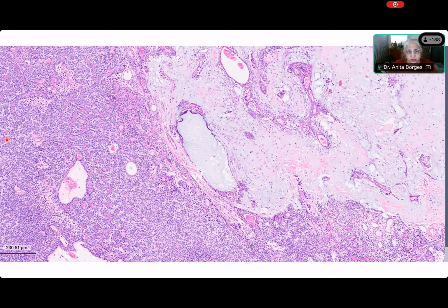Do you see all these cells over here that are forming sheets of cells? Yes, and they're sheets of cells, but they are basaloid. There's hardly any cytoplasm. And what do you see in the middle of all the sheets? You don't see that there are lumina or spaces. Do you see spaces? Everybody can see a space here? Yes, ma'am. Here's a space, and there are lots of other spaces. Now, what's the difference between this space and that space?